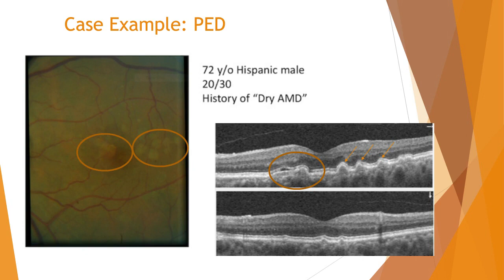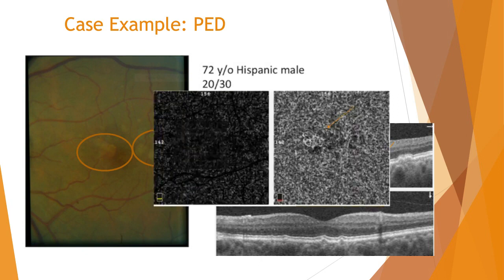So now that we have angiography, we got angiography on this drusenoid PED, and you can see that this patient has a cute little baby bicycle wheel CNV there, originating in the choroid, which makes sense because it's, again, below the RPE. It's an occult membrane from a chronic or long-standing PED.